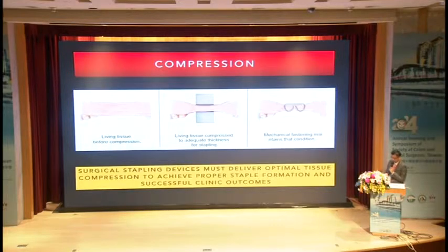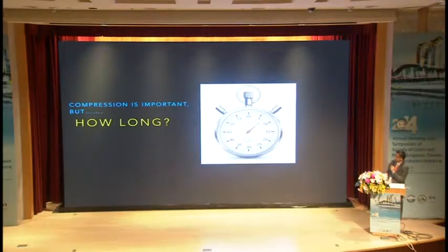The application of pressure to living tissue can achieve an adequate thickness for stapling. Compression can migrate fluid from tissues, which helps to ensure a more consistent thickness in the target tissues. And after compression, tissue is ready to accommodate a secure closed staple. Okay, we know compression is very important, but how long?